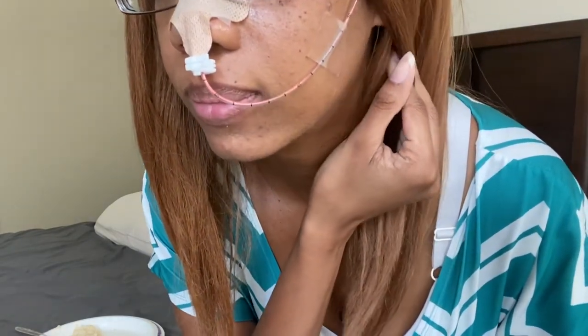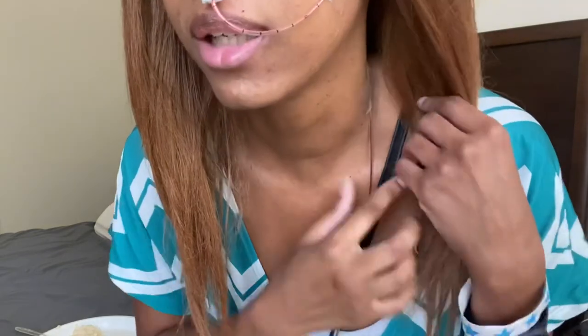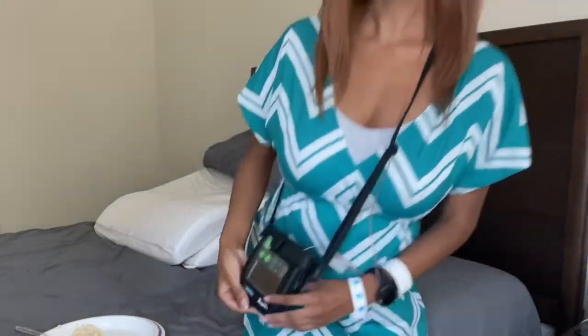And then it goes behind the ears, and then it just kind of comes around and attaches to the machine. The other end of the tube is hooked inside the machine, and the other end is of course in your nose and down to your esophagus, and a bit is in your stomach as well.